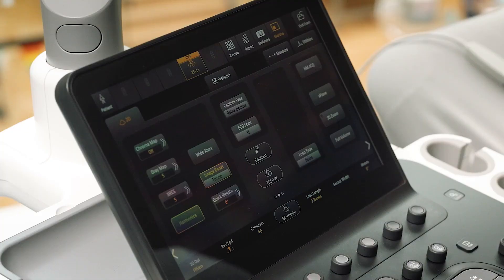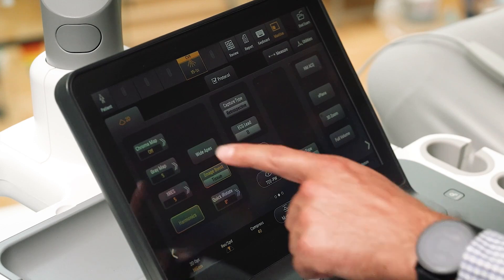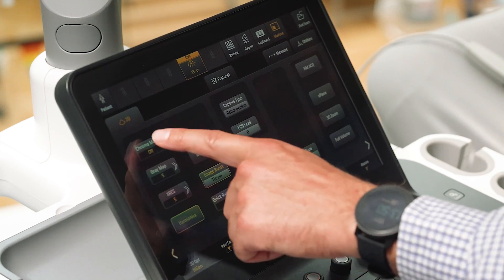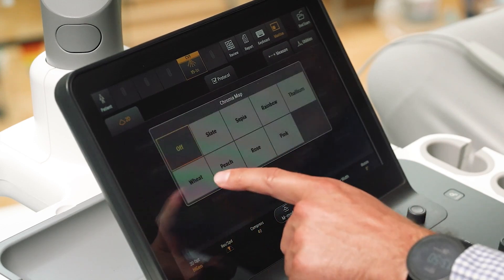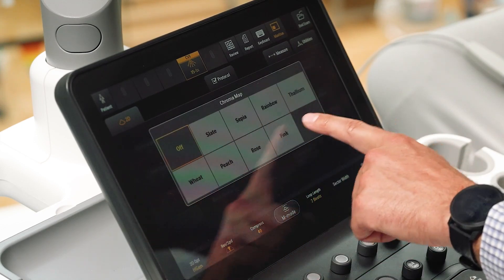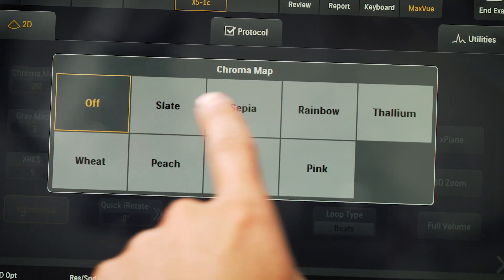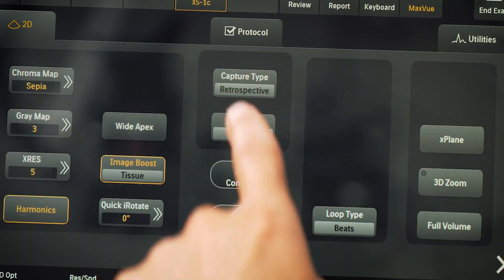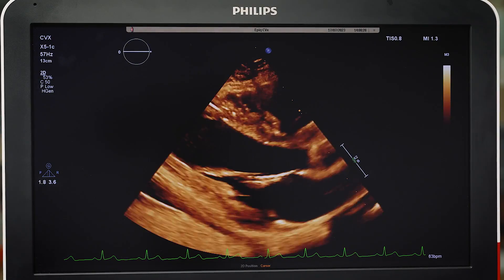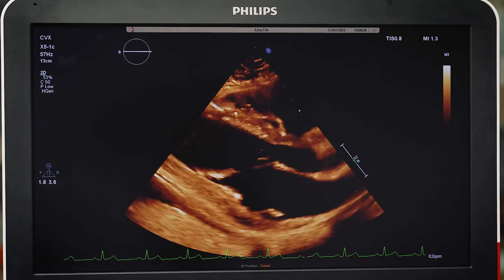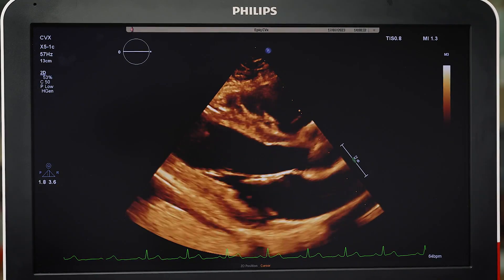Changing chroma maps may enhance the user's ability to view an image. There are various settings to choose from, and these can be altered to the user's preference.